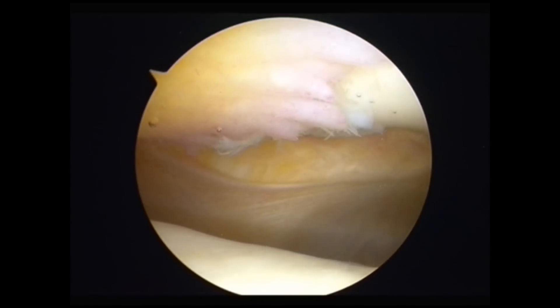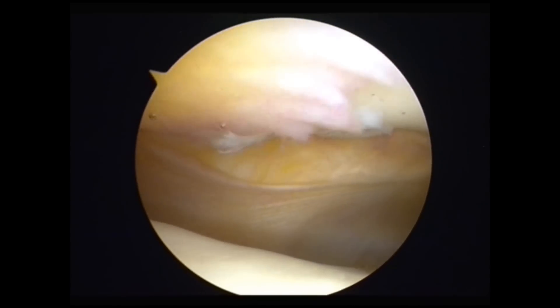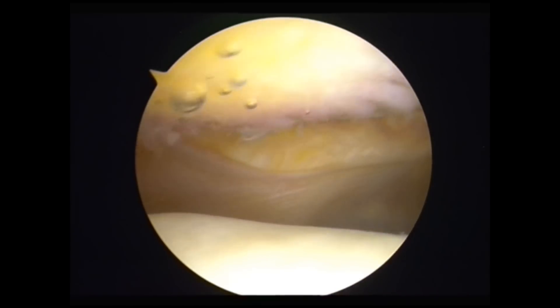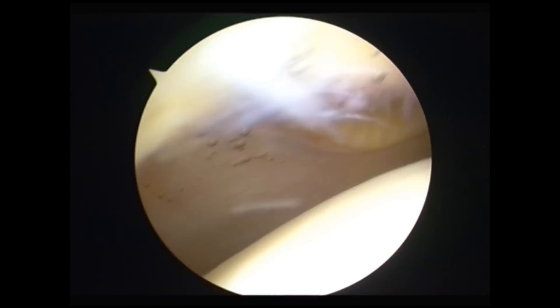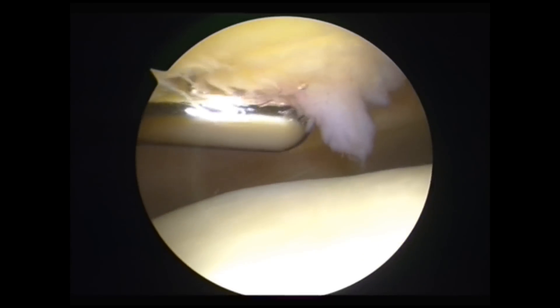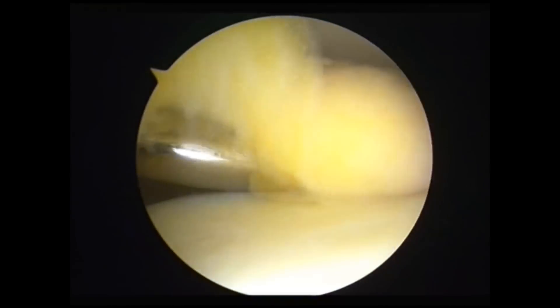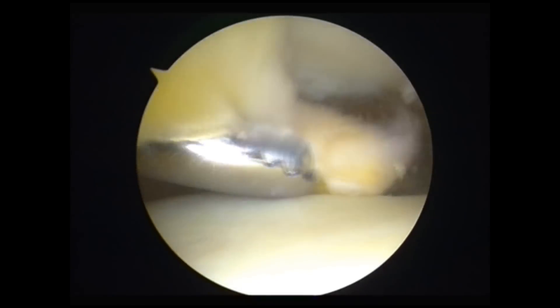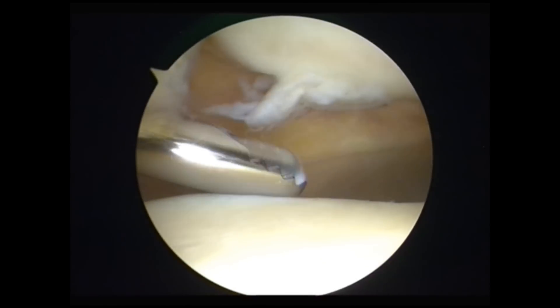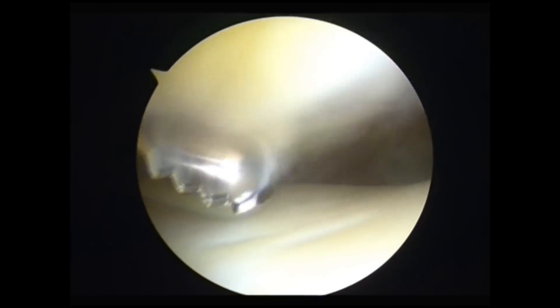Now what we are going to do is shave away that impinging fat pad. That's a Smith & Nephew incisor Plus. That will just shave away and suck out all the fibrous tissue from the joint, not leaving anything in the joint to catch around anywhere later.